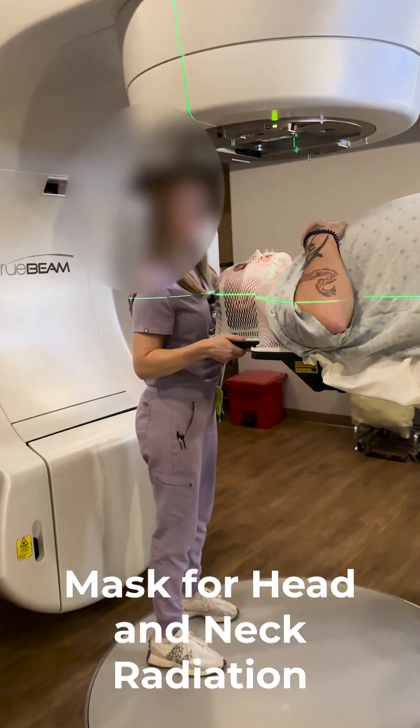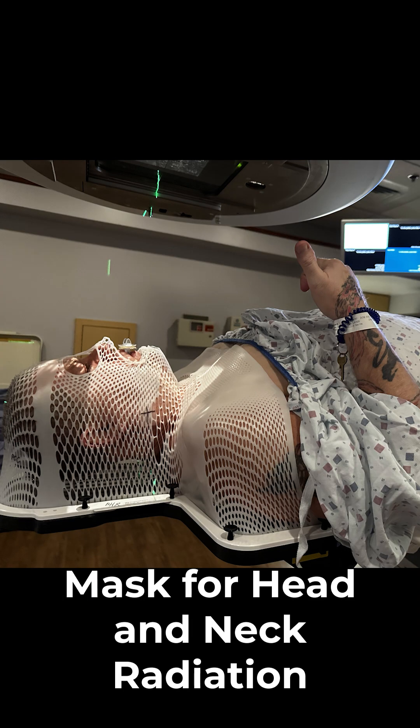They double-check everything, make the machine line up perfectly, and then after that it takes about one minute to do the actual radiation. Total time from start to finish is less than 10 minutes.